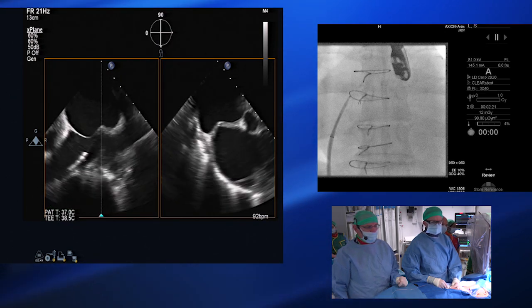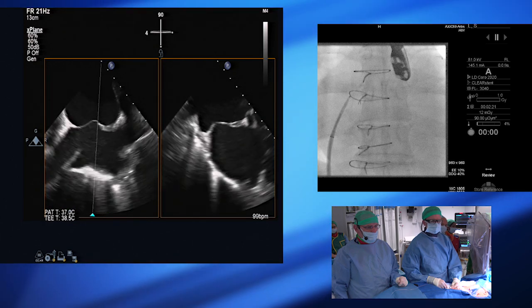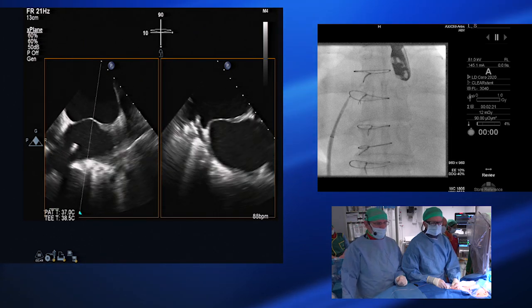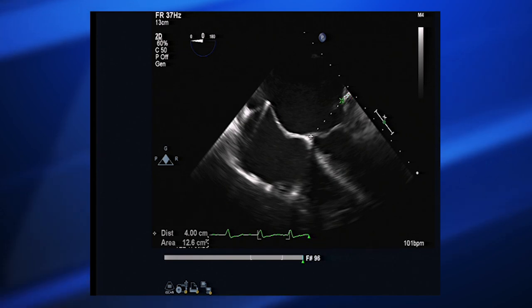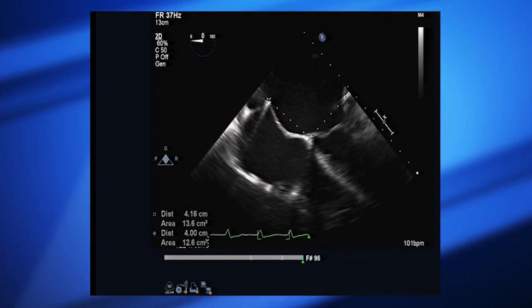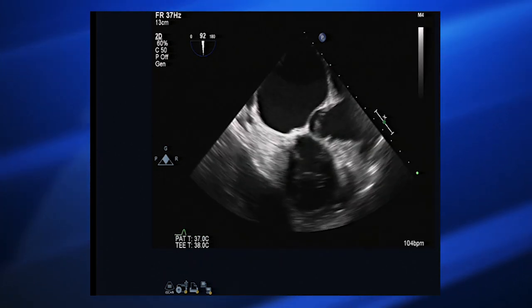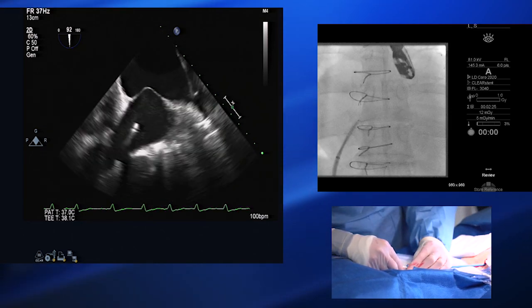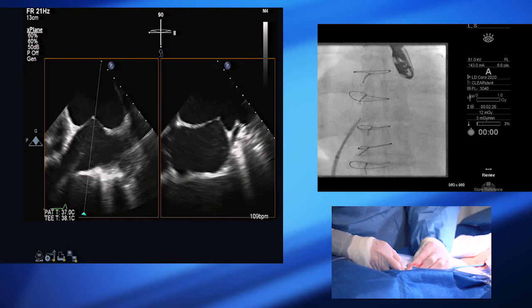It's coming down nicely, looking not bad in the AP — nice and posterior. I'm just inching it down. The measurement is 4.2. It's really important to get this in the right place because it's the difference between a straightforward procedure and an extremely complicated procedure, so it is worth spending an extra minute or two on it.